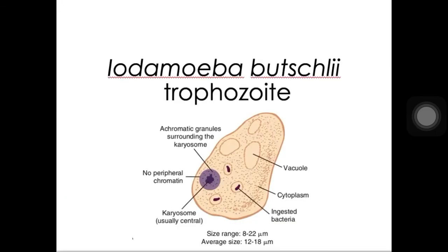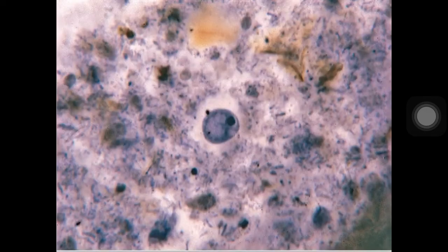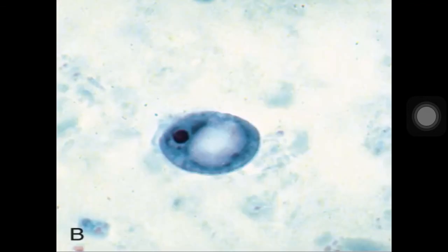Next, so again, that's your Iodamoeba buchli trophozoite. Okay? Next, number 9. Ito po, mas madali na siya ngayon. Alam nyo na to. Okay, mas maganda to. So again, this one is your, syempre, Iodamoeba buchli cyst.